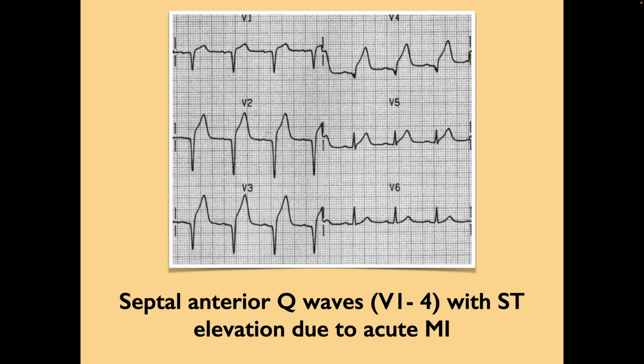So in this particular case, if somebody says we have a septal anterior STEMI, and somebody asked me what the evidence was, I would say ST elevation in V1 through V4, sort of borderline hyperacute, not so much the hyper T's, but I would say the Q waves are evidence of this STEMI that's happening now because it's in conjunction with the ST elevation. Okay?